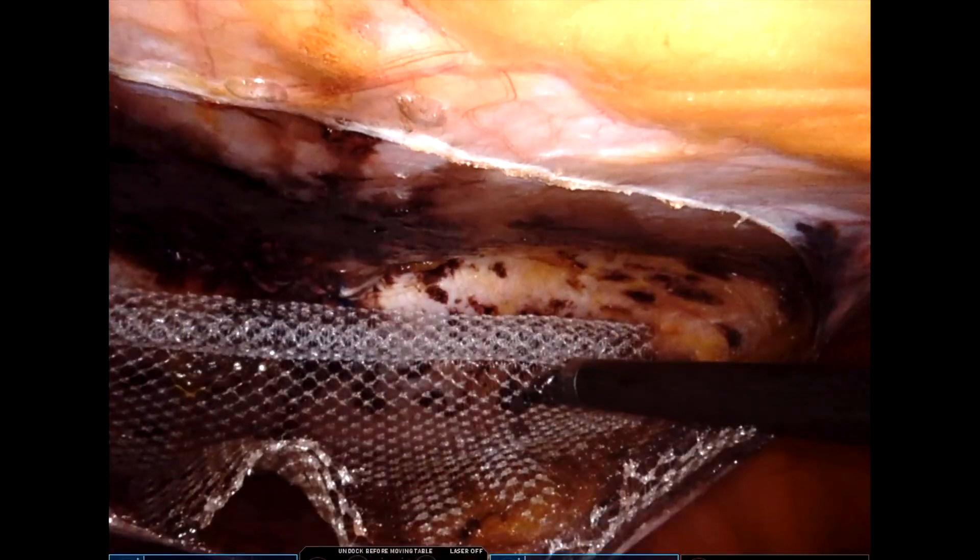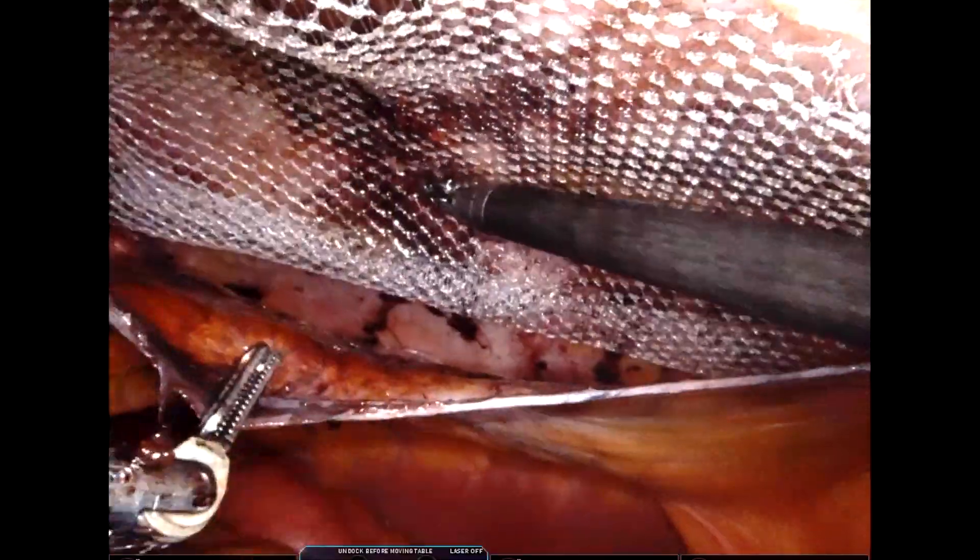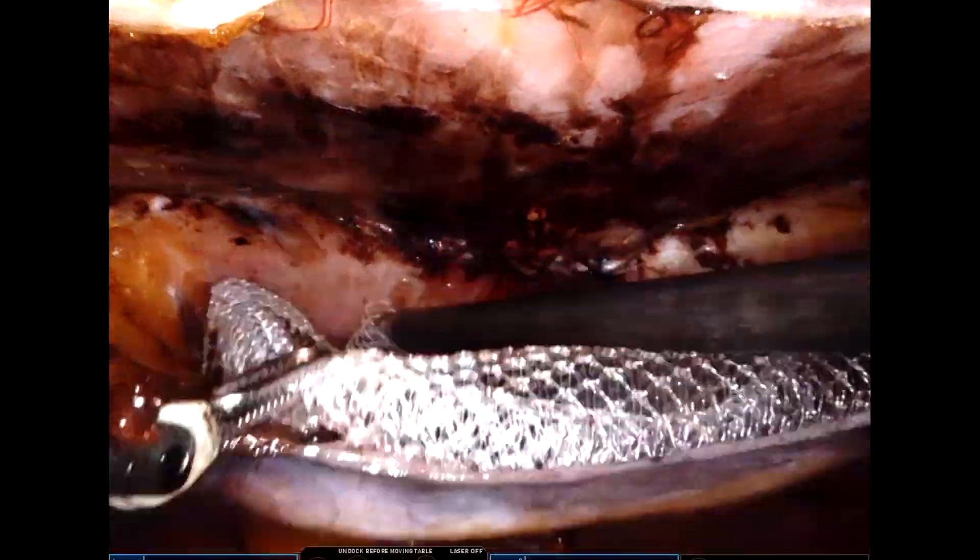This is a 15 by 12 centimeter mesh that is being used here. We find unfolding the mesh easier if it has been folded from both ends toward the center, unlike here where it was folded from one end.